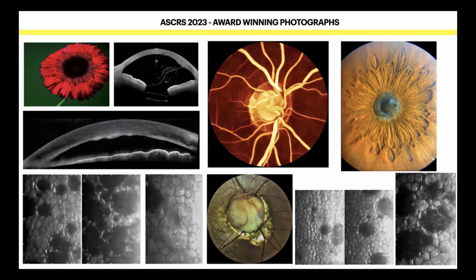What is this image? Anybody else? Glaucoma? Anybody wants to take a wild guess? It's a normal image. It's just a normal image. FFA, can you see the flow? It's technically not a full FFA, it's a normal image. So this is a monochromatic Spectralis normal image, which gave me a feel of an embryo. Can you feel that comparison of an embryo?